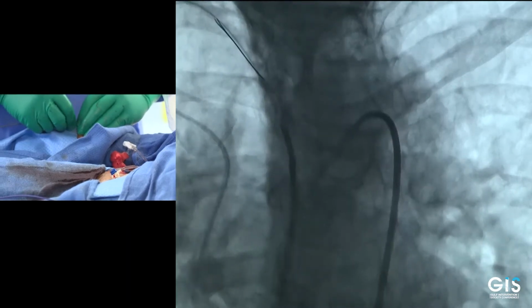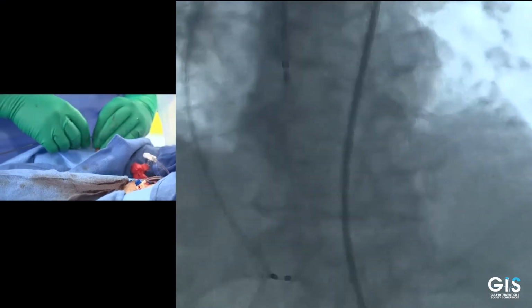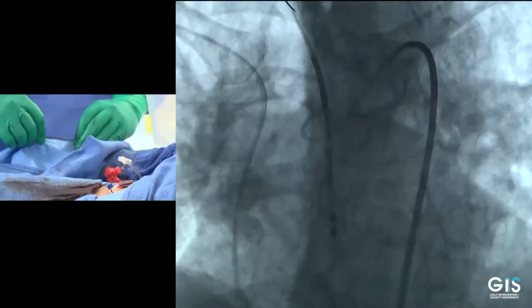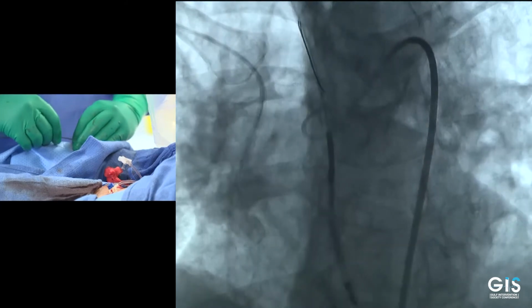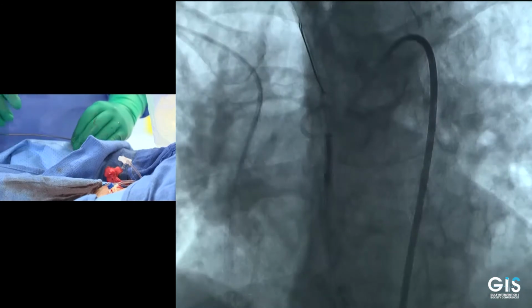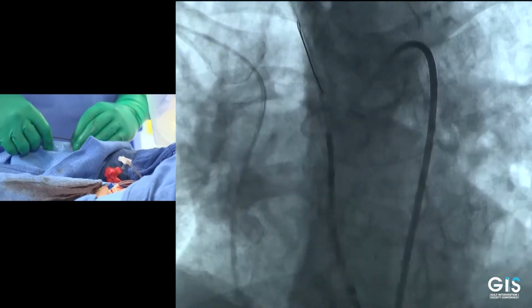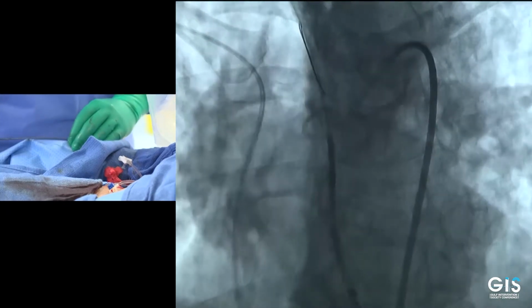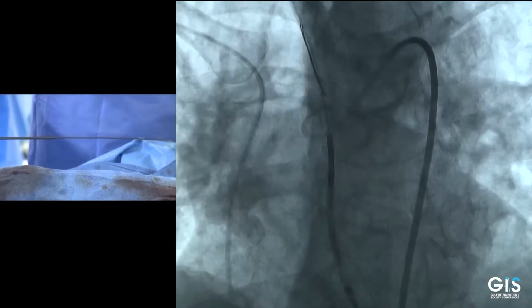So the marker we see on the screen right now is a marker. Come down with the table, please. No, toward you, Salim. Toward you. Yes, stop. Okay, so you could see this marker. As you can see, what seems to be a snare there is located in the proximal segment of this catheter. This is the proximal basket, and now you can see that the tip is almost in the ascending aorta.